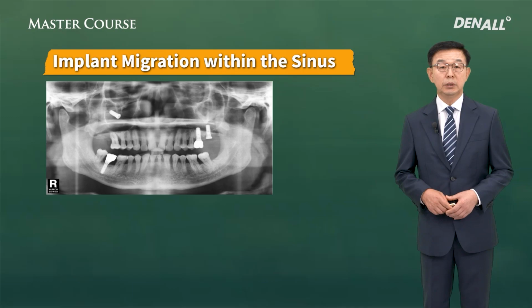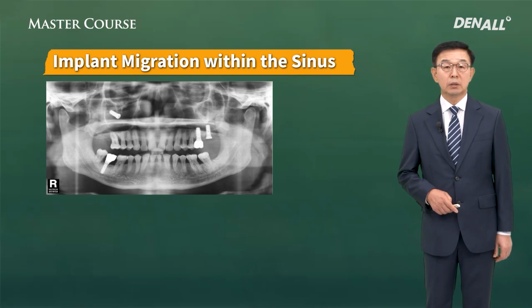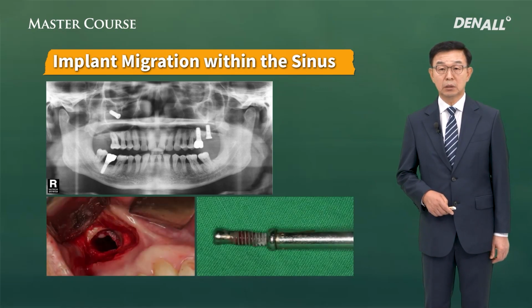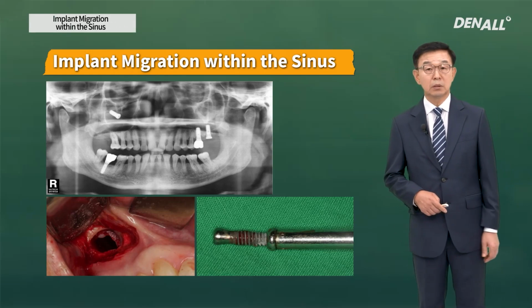In the case of this patient, in number 17, during secondary surgery, the implant fell into the sinus and the patient came to my dental clinic. Immediately, lateral window approach was taken to remove the implant.